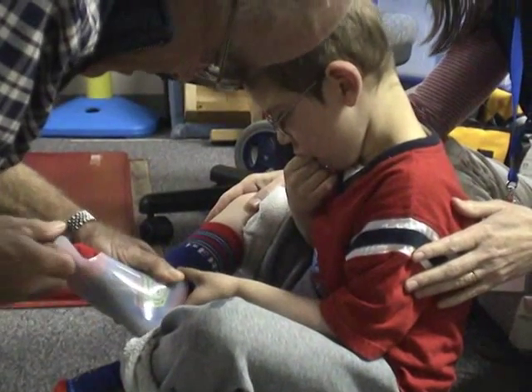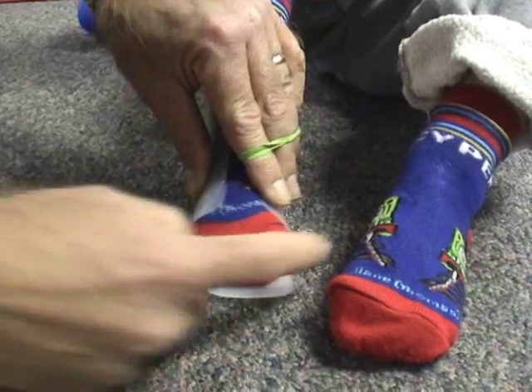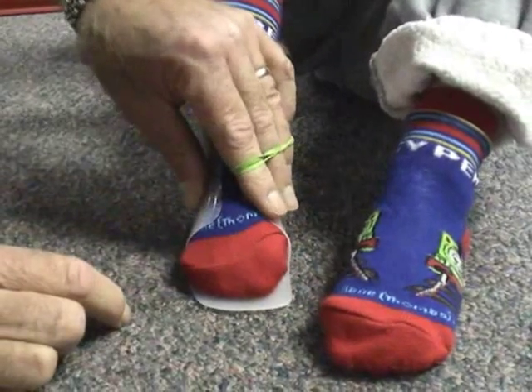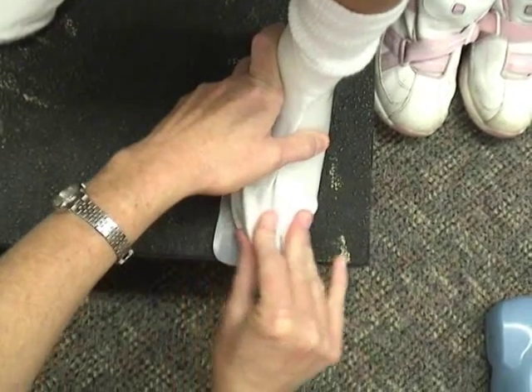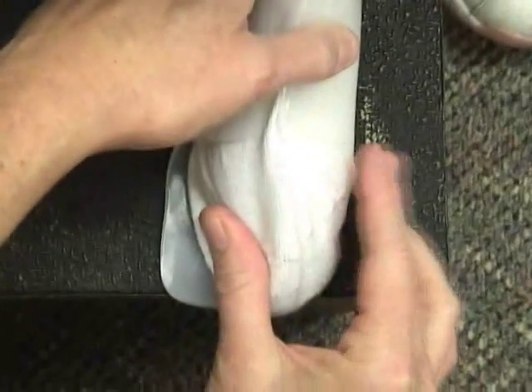After looking at length with the heel seated and instep closure, I usually look to see if the forefoot of the patient is reasonably matching the width of the jumpstart. Forefoot control is very important for overall stability, and if the jumpstart is too wide through the forefoot, the patient's foot will tend to drift to one side or the other and upset the overall alignment.